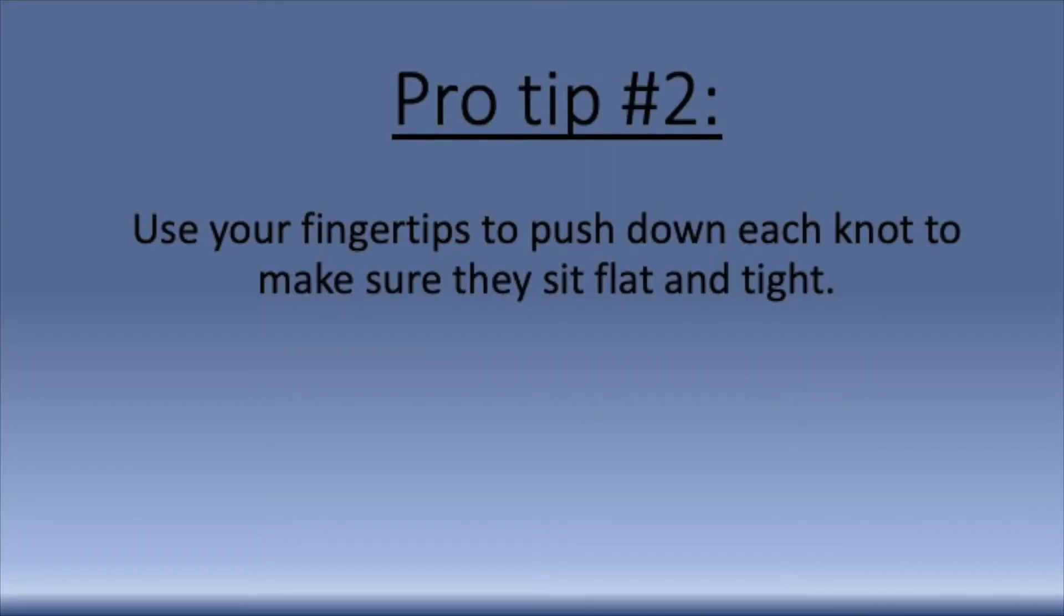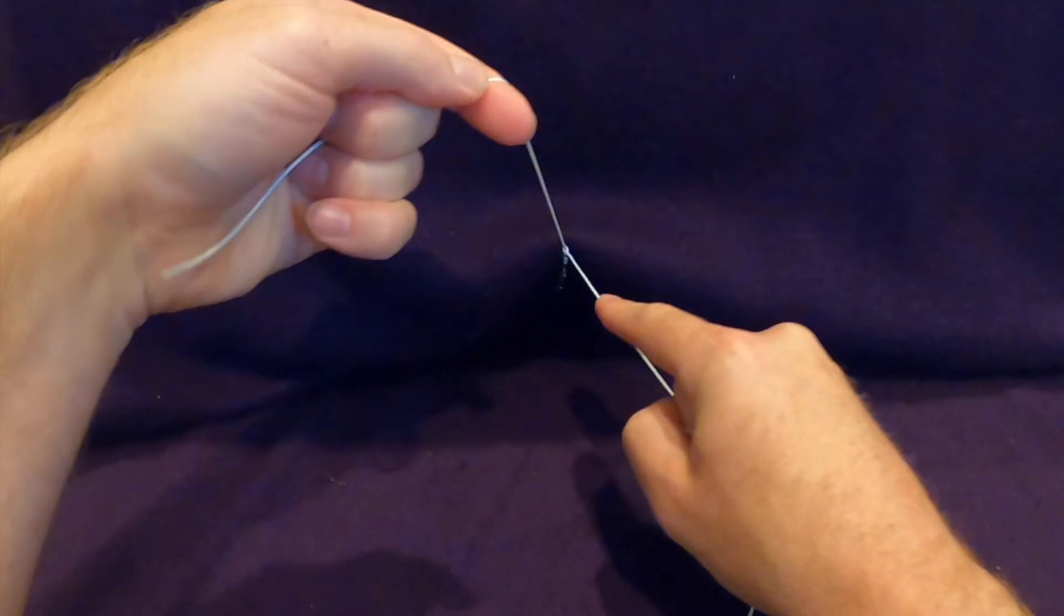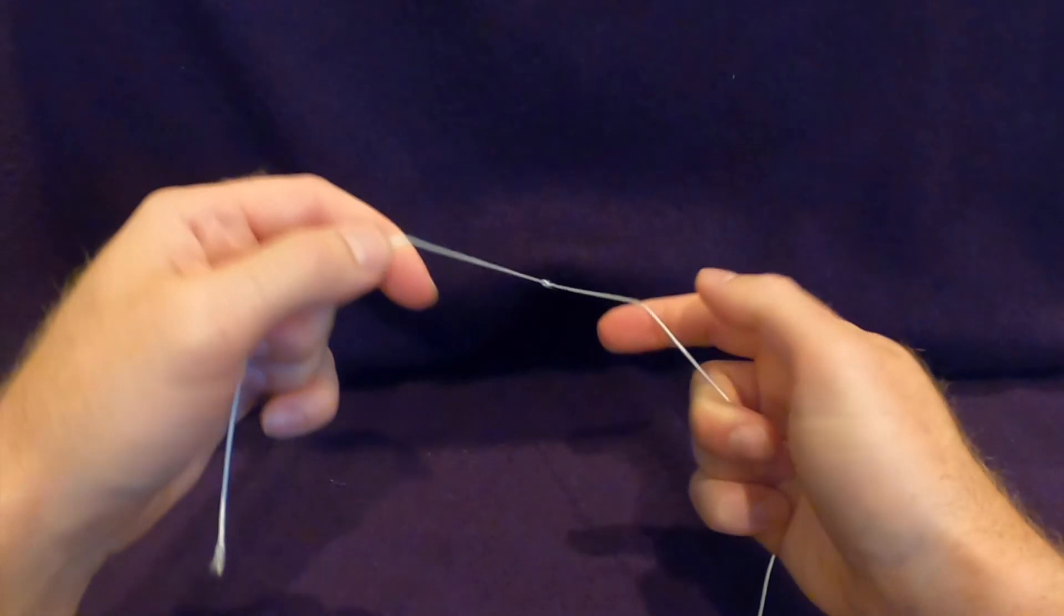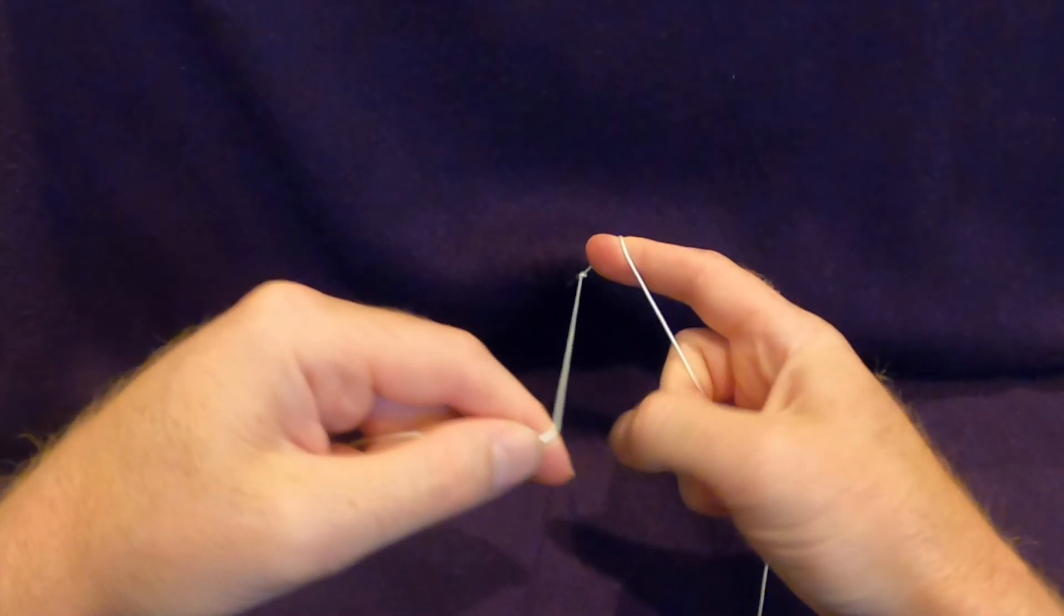When cinching the knot, use your fingertips to push the knot down to make sure it sits flat and tight. The thumb and index finger move back into the C position and we're ready for the next knot.